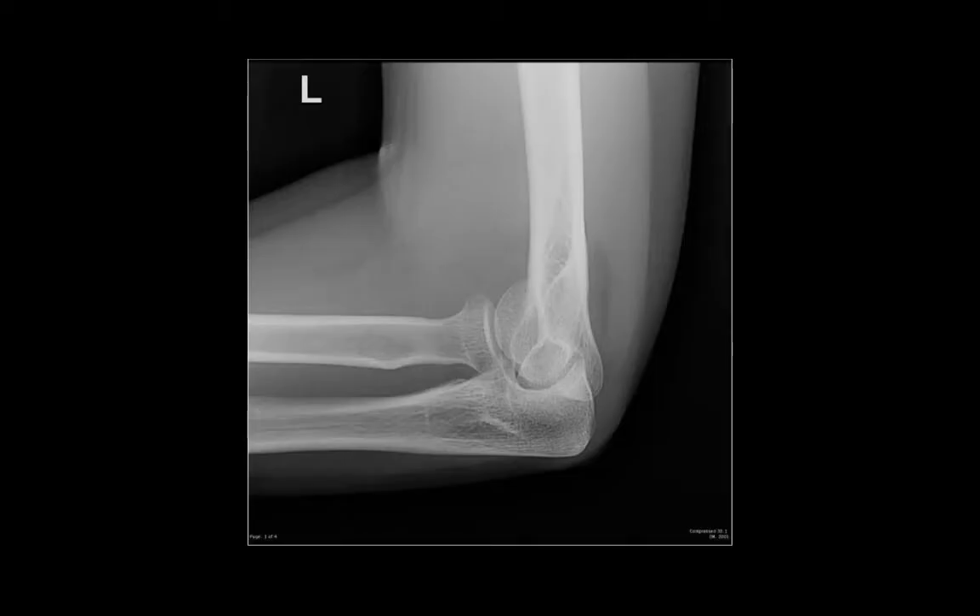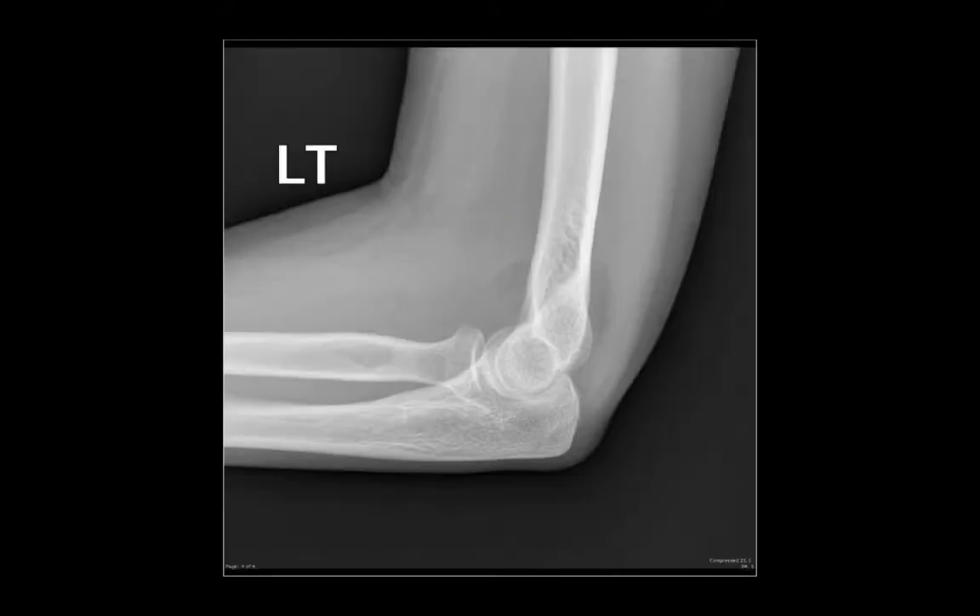Here's a film of an elbow that doesn't look quite right. There's a bit of bunching around the distal humerus there. With a little bit of repositioning, we can see the figure of 8 and we know that it's a true lateral and can go on and reassess it appropriately.